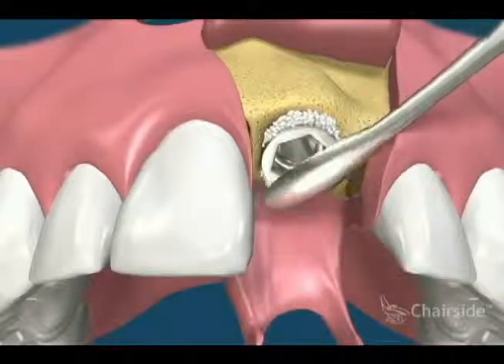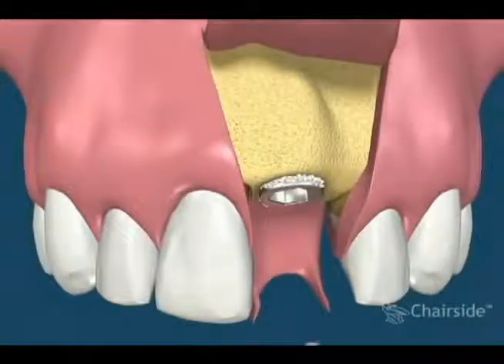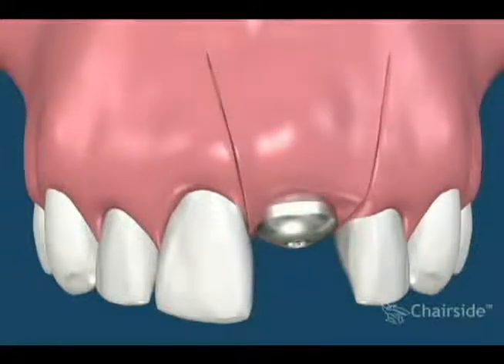Bone or bone substitute from various sources can be placed in the void. The implant is covered with a healing cap. The gums are repositioned and sutured into place.